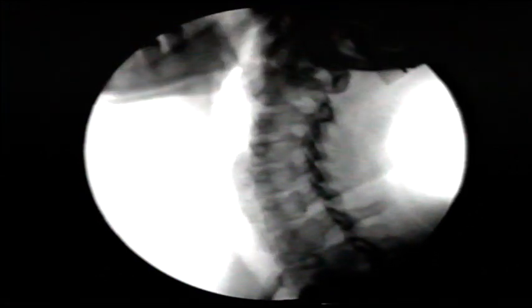Based on the results of previously reviewed plain radiographs, as well as the results of the video fluoroscopy, which we have demonstrated in the beginning of this tape, the patient has a gaping of the facet joints at C4-5 levels bilaterally, as well as hypomobility at C2-3 level on the left side. At this point, I'm going to mark the skin accordingly.